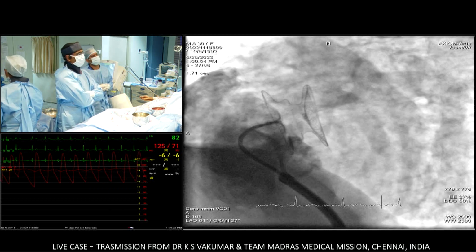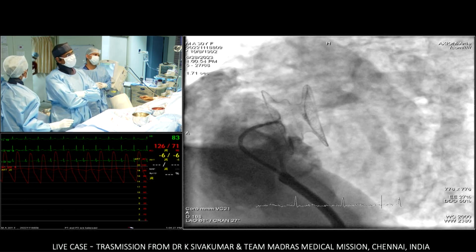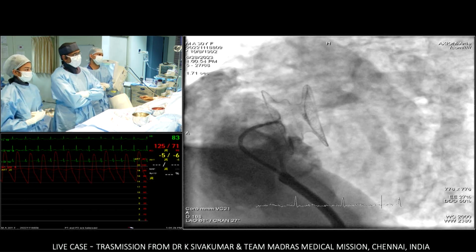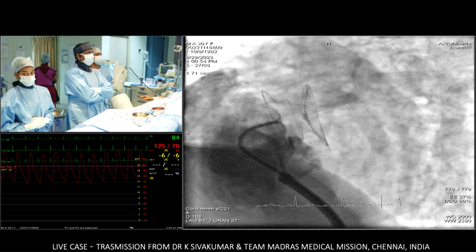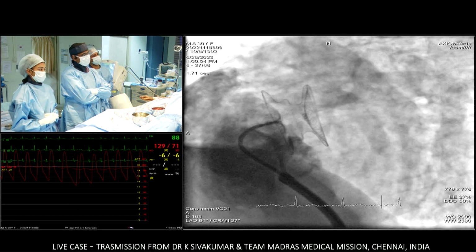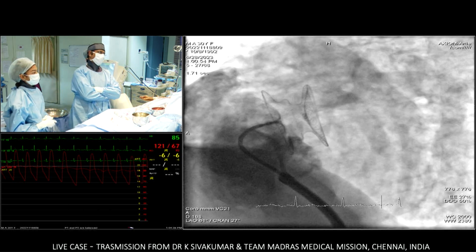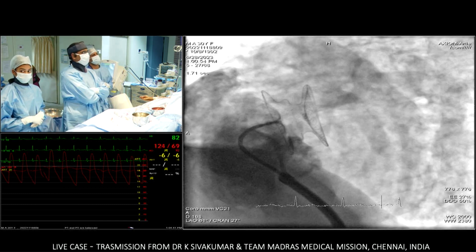Okay, so the septum primum, which is actually deviated towards the left, I have now caught it with my larger waist. The superior part, I don't have a very clear view. Go back. Just go a frame back.